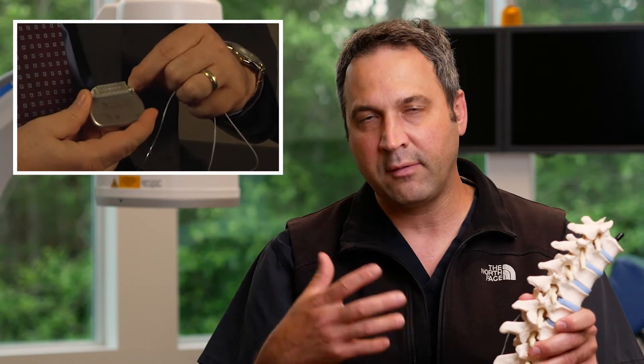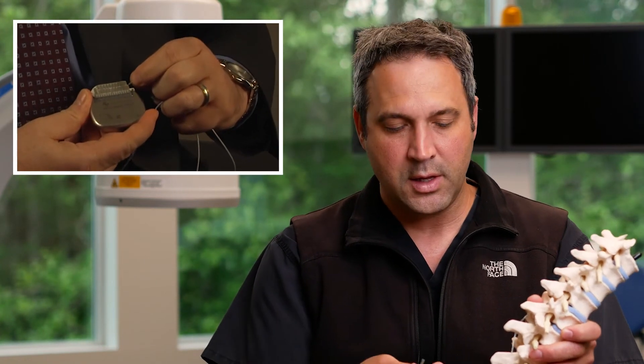You wear that fanny pack around for six to seven days. During that time period, with the assistance of the representative and your pain team, you can run through various different programs with the assistance of the patient-controlled device to tune in specifically for your pain pattern. For that trial phase, you get six to seven days to zero in on the pain control for you specifically.